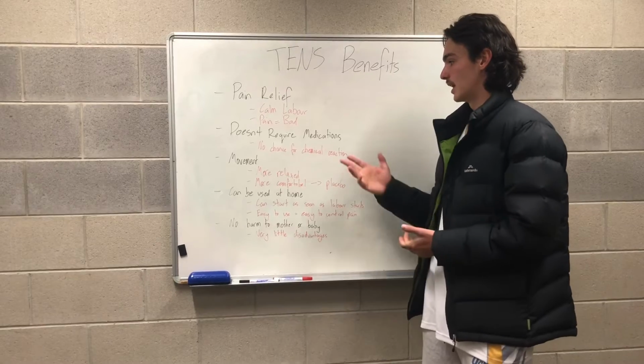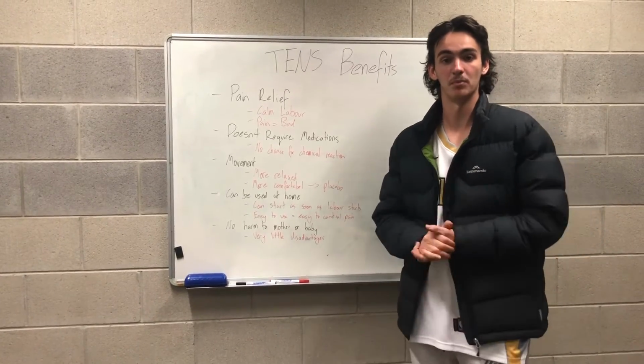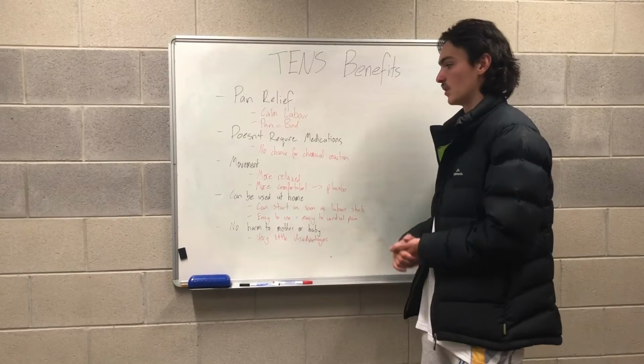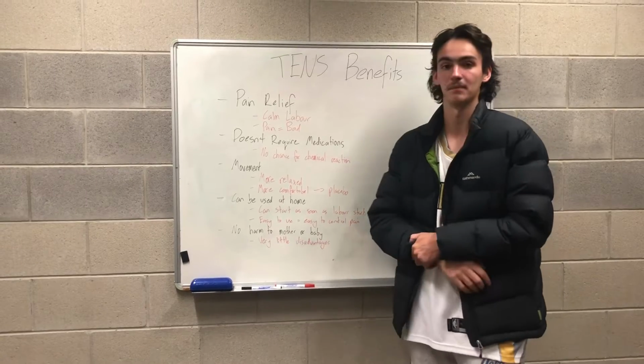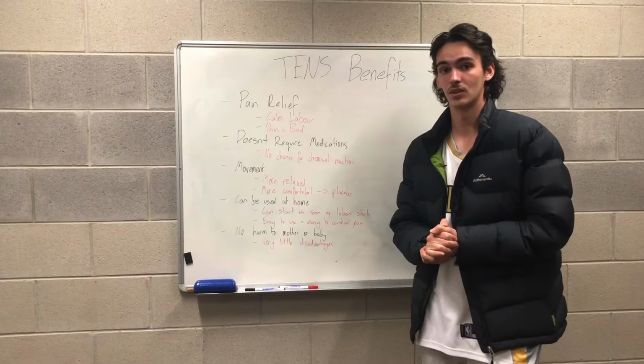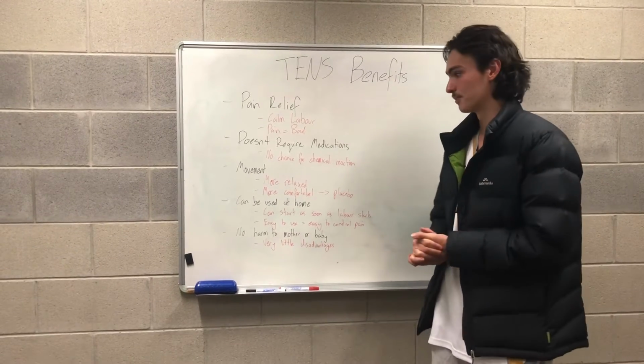Following on, it doesn't require any medications to take, as it's just a few pads stuck on the body here and there, and electrical pulses controlled by the user. So this leaves no chance for any sort of chemical reactions or anything like that. There is a chance for some allergic reactions with the pads, but we'll speak about that later on.